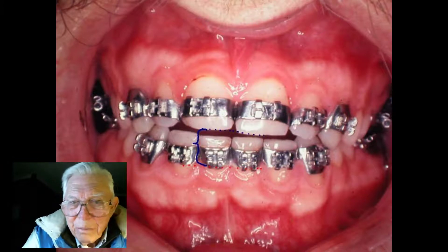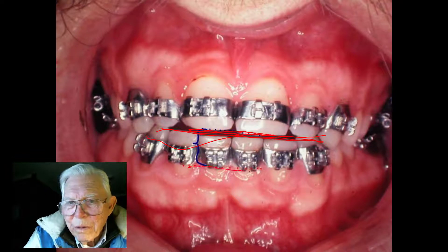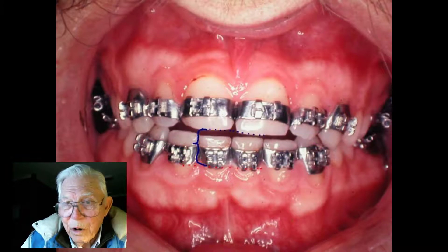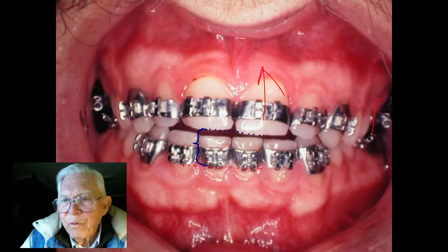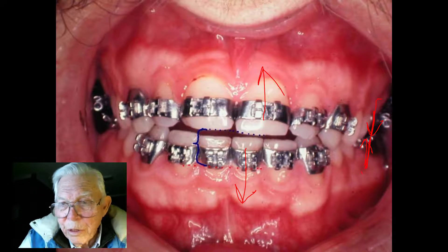This is why he came back — he could not bite his teeth together out in front. These lower teeth were down on the tissue, you couldn't see anything. That's opened up with the force of these wires. The force that pushes this up is just as much as the force pushing the molar teeth down — what pushes these down is pushing this tooth up. These two molar teeth were being pushed together.